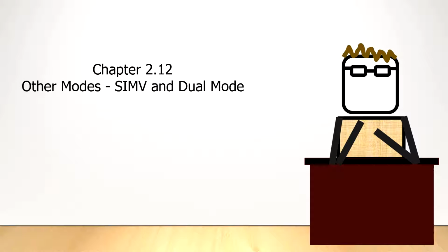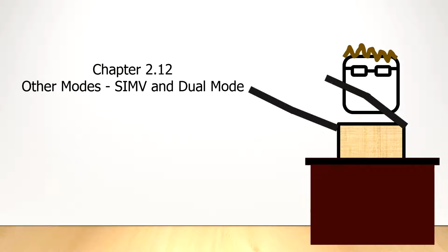Welcome to A Basic Introduction to Mechanical Ventilation. This is Chapter 2.12, Other Modes of Ventilation.